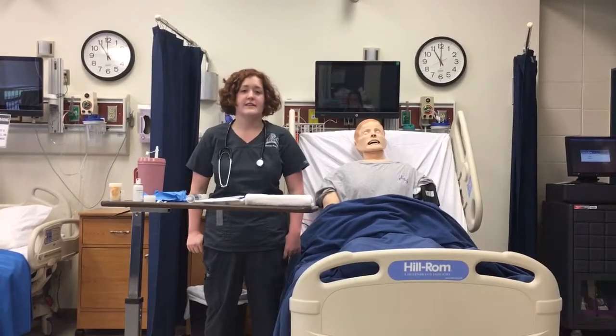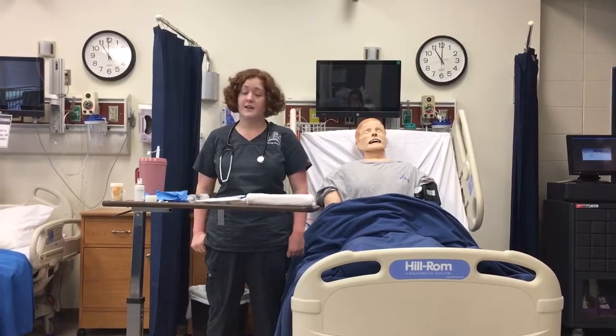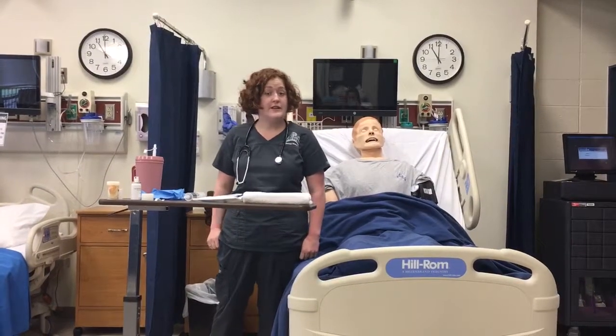Hello, my name is Taylor Erfling. Today is April 13th. It is 11 o'clock in the morning and I'm going to be inserting an NG tube today.